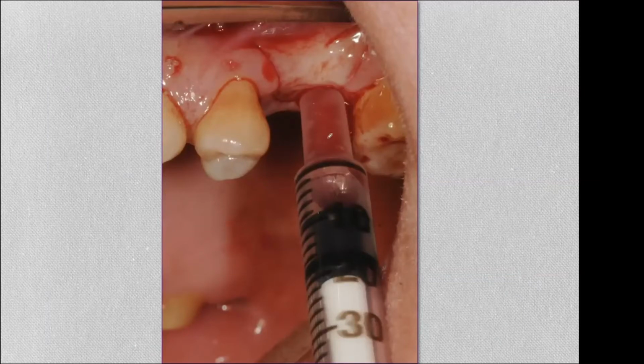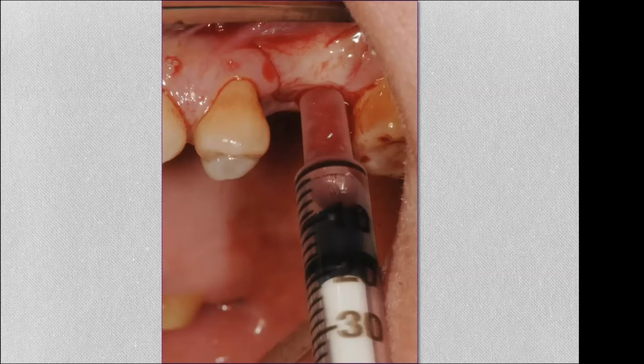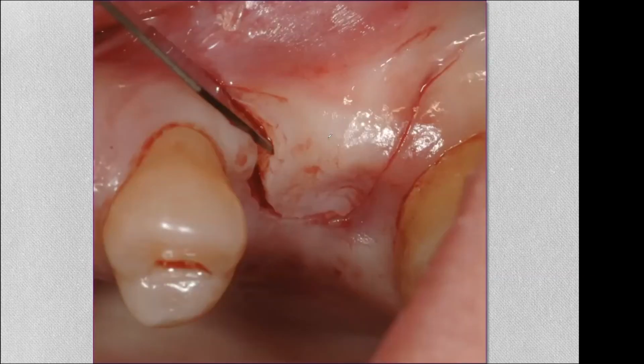And as soon as we make the incision for the SynthoGraft, and this is a very important point, the inventor and manufacturer's recommendation is that it be mixed only with blood, the blood of the patient. So I usually, as soon as I make the incision, draw some of this mixed arteriovenous blood coming from the incision, and set it aside. For a single tooth graft or for a minor internal lift, you roughly need maybe a fifth or a quarter of a cc, if that. Okay, that will get a quarter gram very nicely moistened for the procedure. Set that aside. Even if it coagulates, we break down the coagulant and mix it thoroughly with the graft. Elevate a flap.